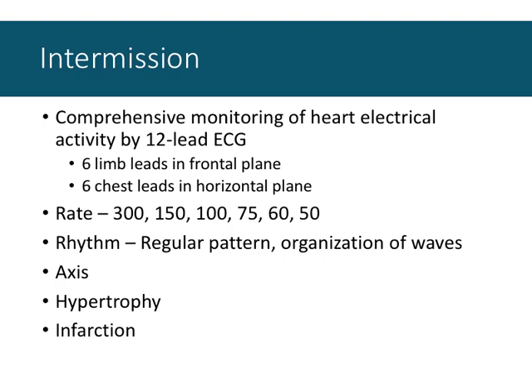But we know how to set up the 12-lead ECG. We've talked about rate. We've got that down pat. And rhythm, we're trying to get under our belt as well. Whether the waves in organization are regular. But that will only come with practice. Lots of information today. I understand if it doesn't make immediate sense, but we'll review and discuss as we move forward. So axis, hypertrophy, infarction on Thursday in preparation for lab Thursday afternoon and your own diagnoses.